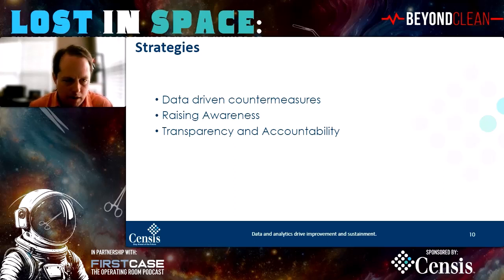Having looked at quality defects, for example, for many years, sometimes we'll see a nurse will say, had a problem with one of the trays, right? Okay, well, that's great. Which tray was it? What was the procedure? What was the problem you had with the tray? I can't do anything with just that piece of information.